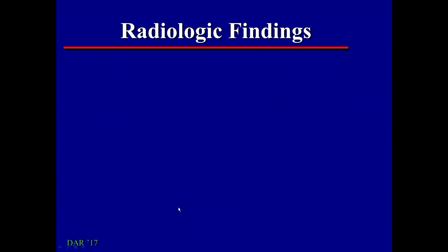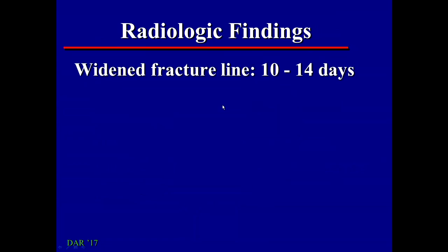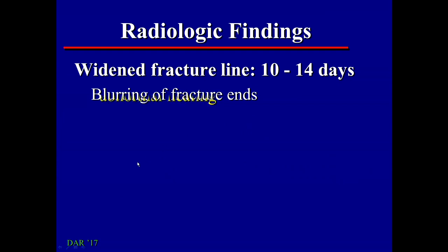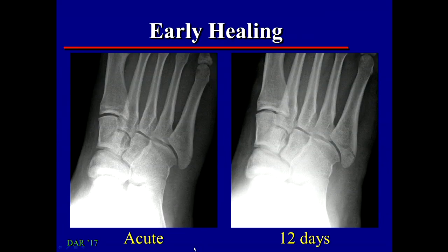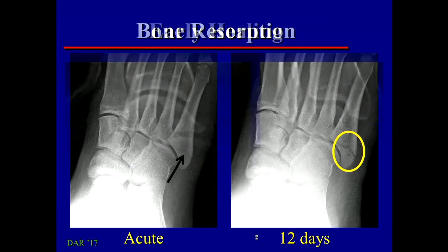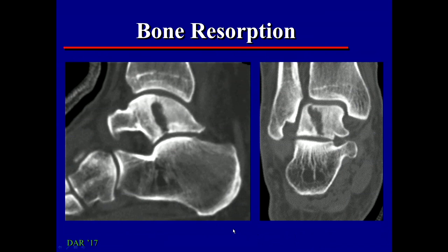The radiographic findings of fracture healing start with widening of the fracture line, and this happens in the first 10 to 14 days. This represents the stage where the dead bone is being carted away. We see this as blurring of the fracture ends as well as widening of the line. Note that widening of the fracture line is the first stage of both normal and abnormal fracture healing. Here's a patient with an acute fracture of the fifth metatarsal — 12 days later, that thin sharp line has become a wider line. Here's a fracture of the talus, a transchondral fracture, where there's been a lot of bone resorption along that fracture line — that can still be normal or abnormal.